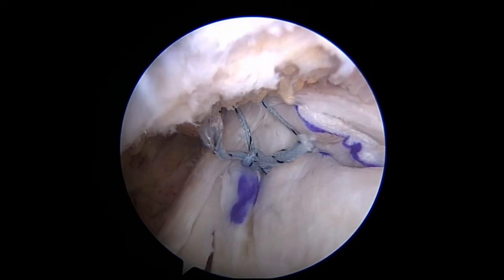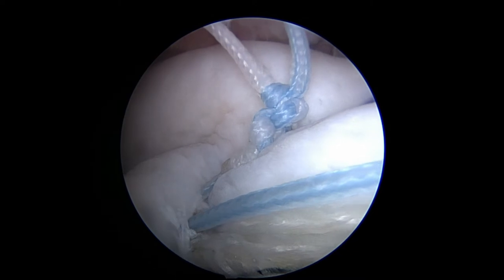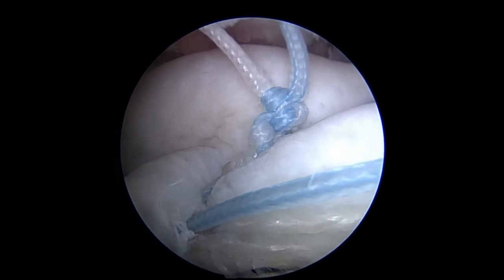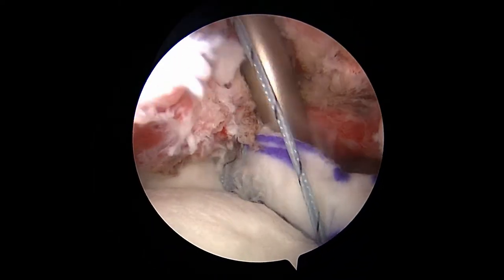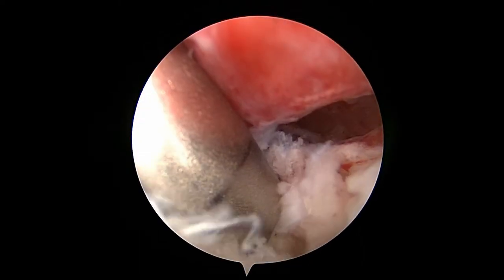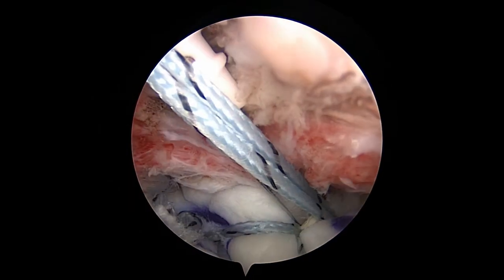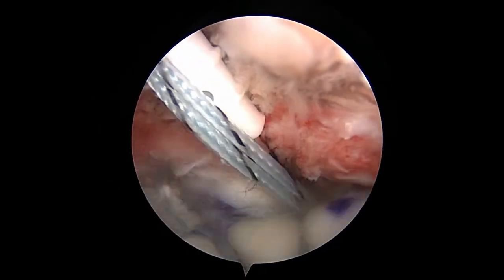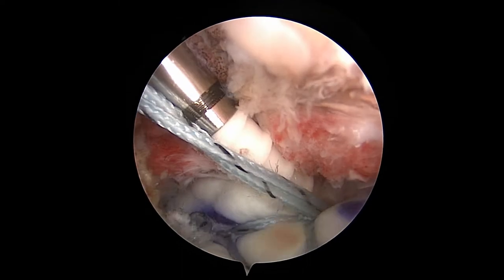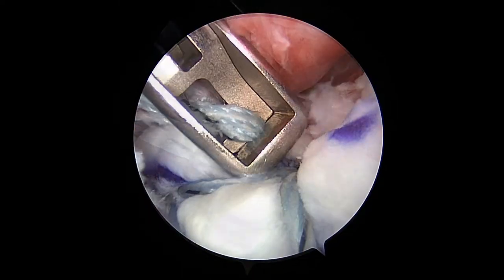The medial double pulley sutures are brought through the Neviaser portal and tensioned. The lateral double pulley is tightened by pulling on its sutures. A bone hole is prepared through the Neviaser portal on the medial glenoid neck. A labral SwiveLock suture anchor is used to secure the double pulley sutures. The anchor is implanted and the excess sutures are cut, completing the medial glenoid attachment in a pasta bridge configuration.